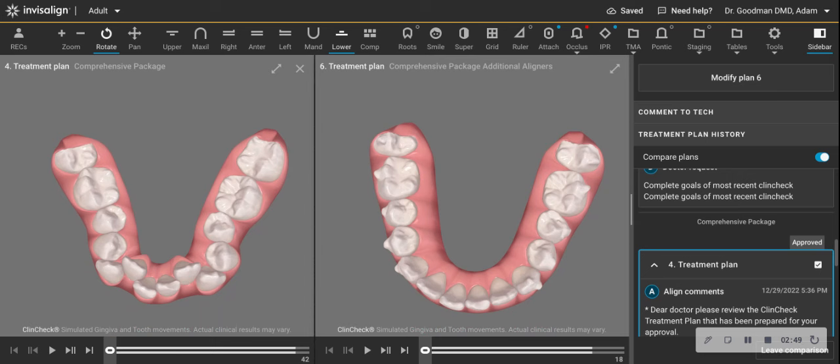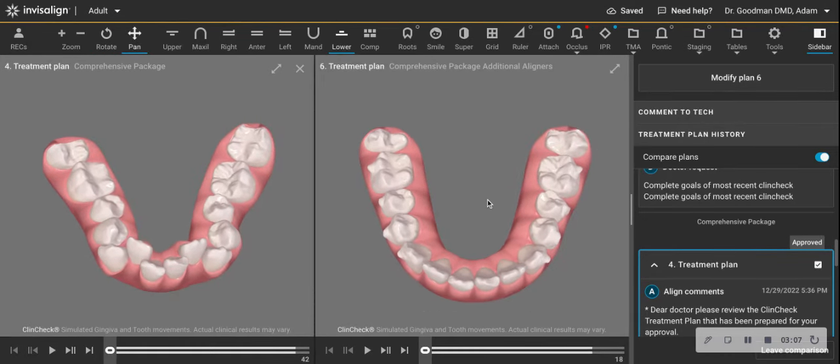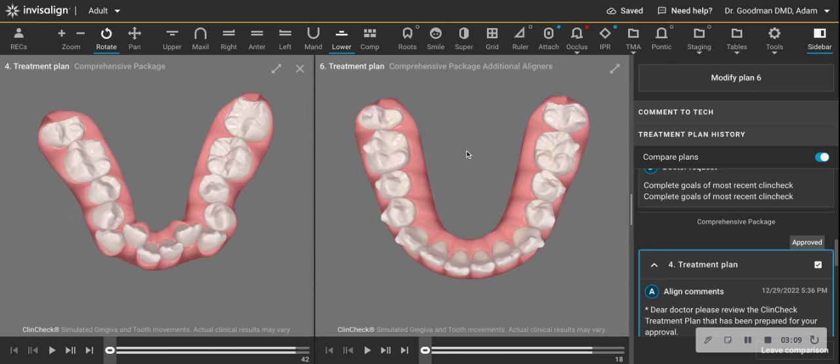And now you can play this out and find out for yourself what your result will be if you either extract or don't extract. And I also, again, want to speak to the fact that Invisalign, it's a complete misconception that it is not effective for challenging cases. This case is about as hard as it gets, and it is playing out perfectly. We still have some work to do, but I'm really proud of this result, and I love using Invisalign whenever I have the chance. It's a great appliance.